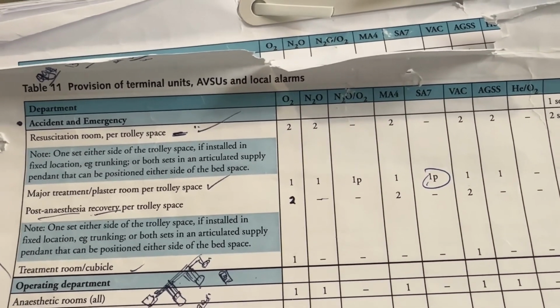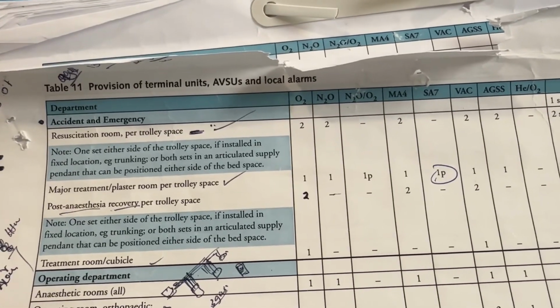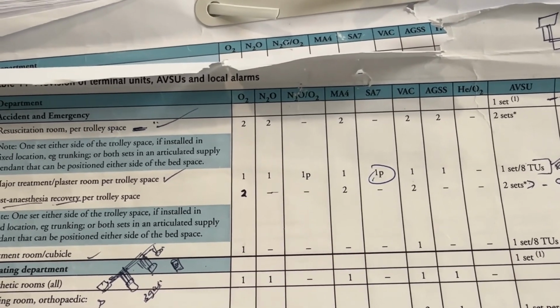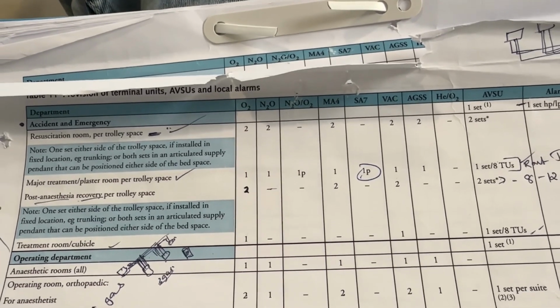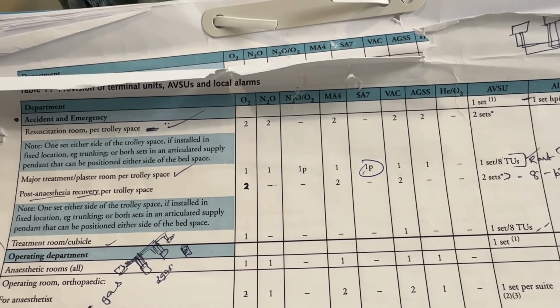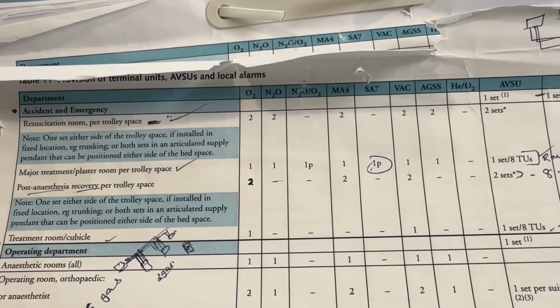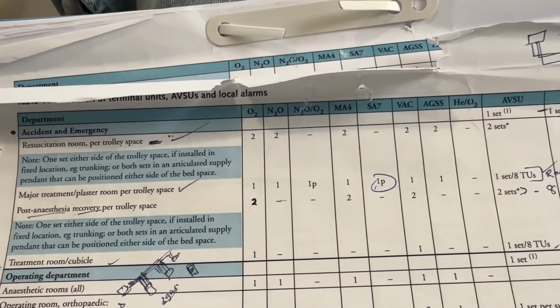The last room is the treatment room and cubicles. The normal cubicle means 1 room with 4 beds or 2 beds, like the treatment room. As per HTM only oxygen and vacuum, single set, but in most cases we give medical air also. It is the requirement of the client, or the biomedical department, doctors like that. Let's talk about each room and briefly how we can give the medical gas.